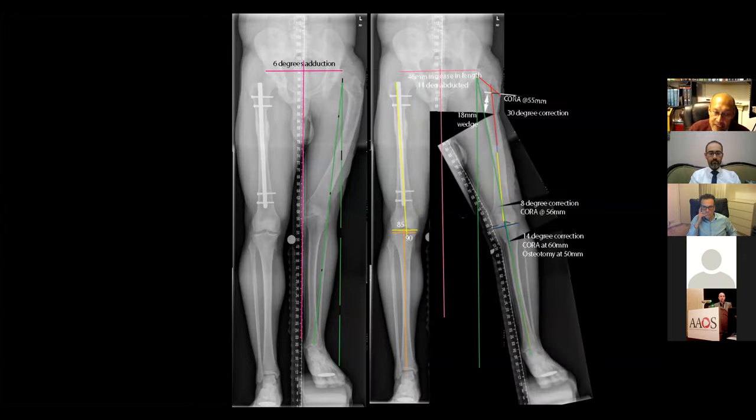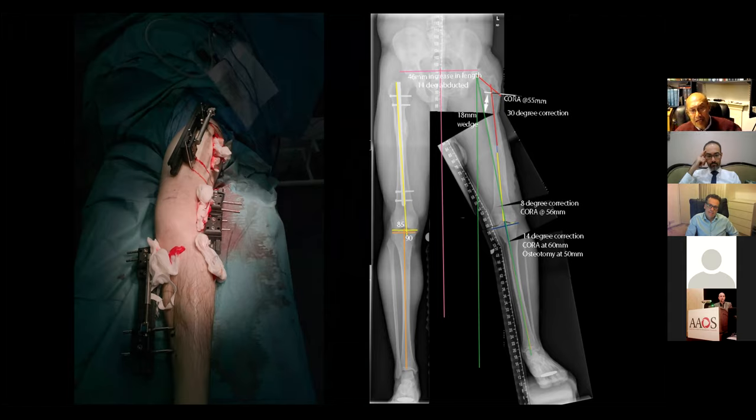If you analyze the deformity and perform a software simulation, you will see that you would need at least 3 osteotomies to restore this patient's mechanical axis. And you cannot, even with trying, cut down the number of osteotomies to get the optimal correction. In using a monolateral system, using the ORDER, so this is order by name and order by design, you can actually use 3 monolaterals, each one controlling each single osteotomy, and you're able to adjust your correction at each level until your final mechanical axis and your joint orientation angles are within normal limits.